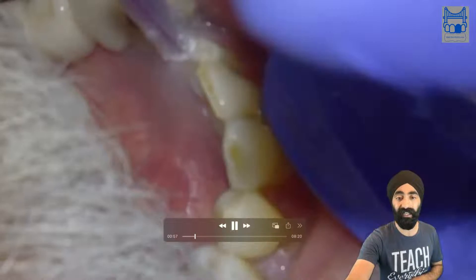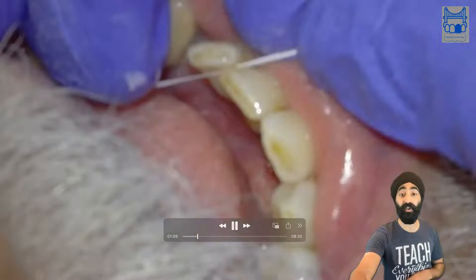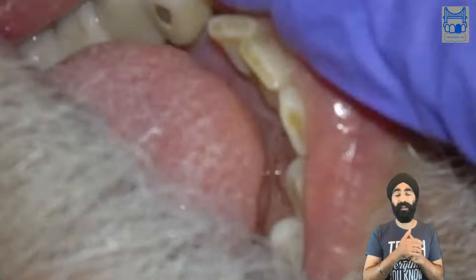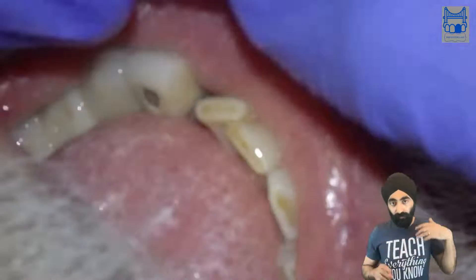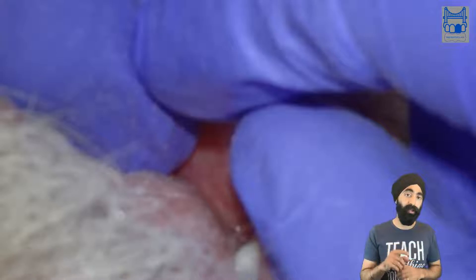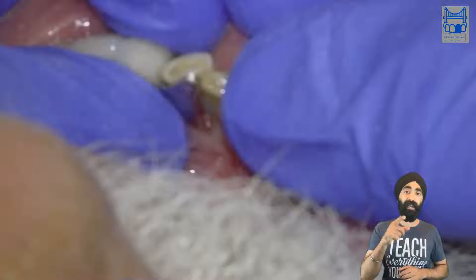Nice and clean. I spent so much time — the sad thing is this patient had this resin bonded bridge re-cemented once and it only lasted a week. I'll show you why. You can see a bit of cement that got out there. This is what I think happened when the bridge was re-cemented.